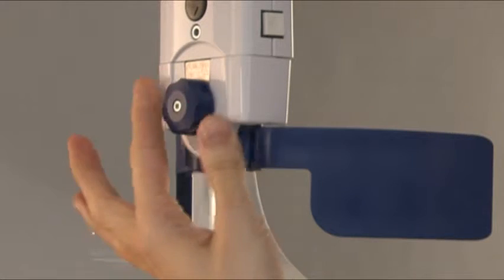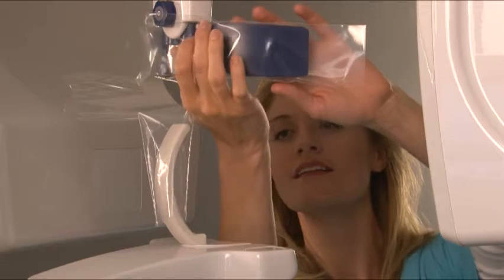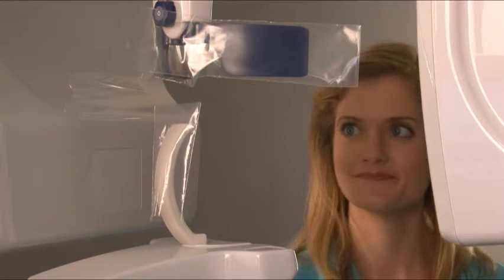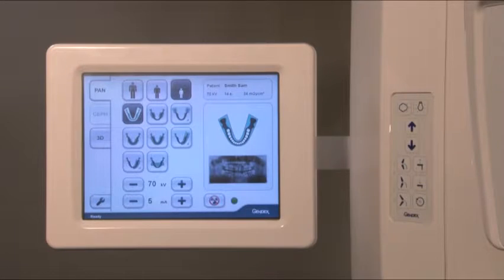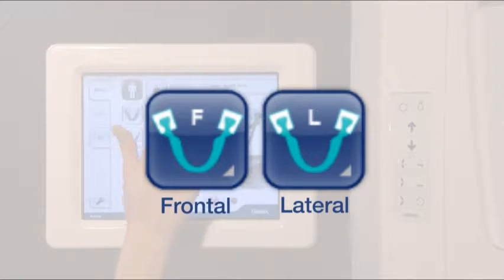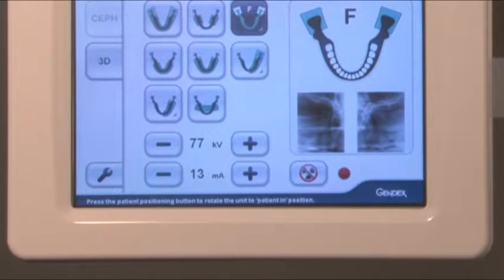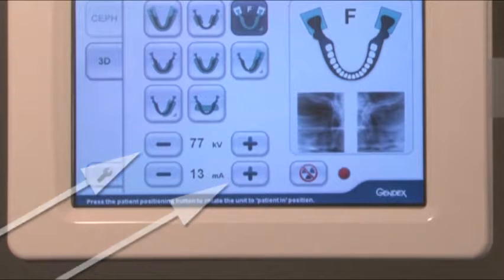Open the head support by turning the knob, then pull the head support assembly fully forward. Place the appropriate barriers on all head supports. Ensure that the pan tab is selected, then select patient size. Select the appropriate TMJ projection. Exposure settings are predetermined by selecting patient size and projection; however, kilovolts and milliamps can be adjusted at this time.